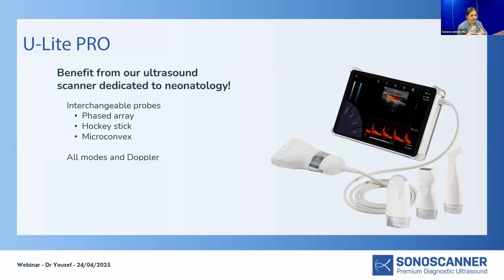The smallest babies often have problems keeping the lungs open, right? An irregular, thick pleural line, going all the way to the more severe cases. These are children we don't have a lot of data about. I know other countries have BPD babies who stay at the hospital for many months, and we're waiting for data from them.